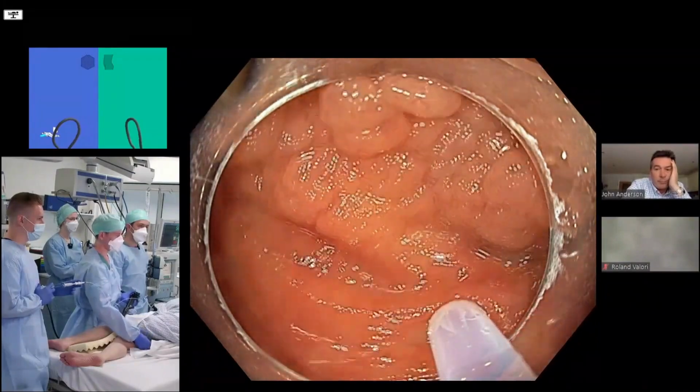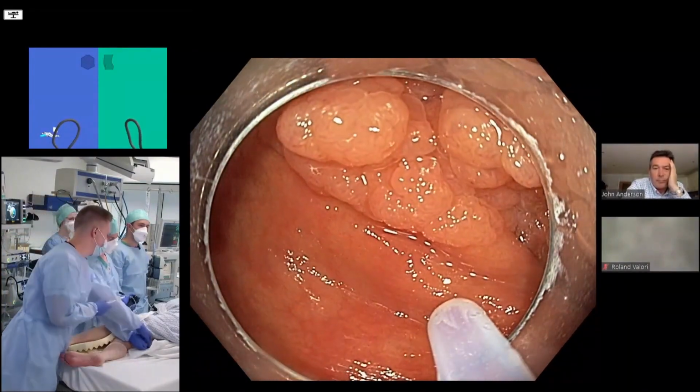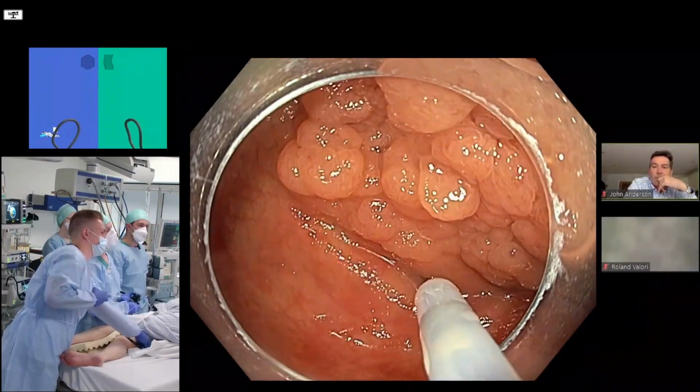Because there's still a polyp there, isn't there? Seems pretty good, doesn't it? Good tip control, yeah. That's that.